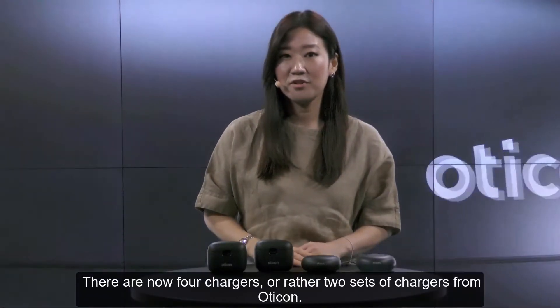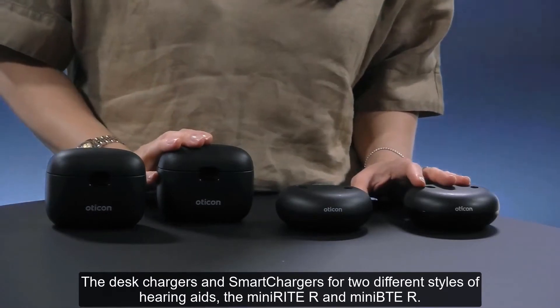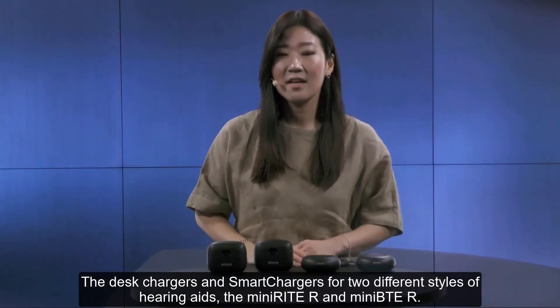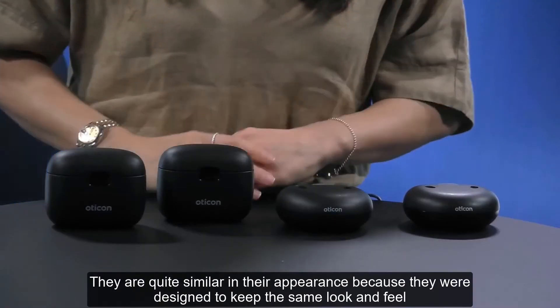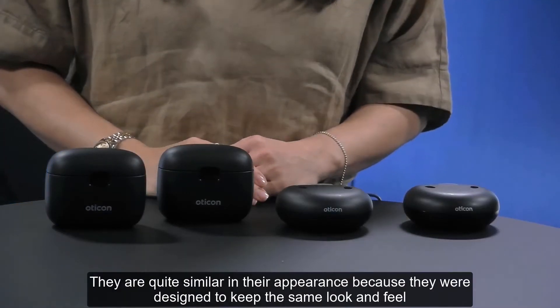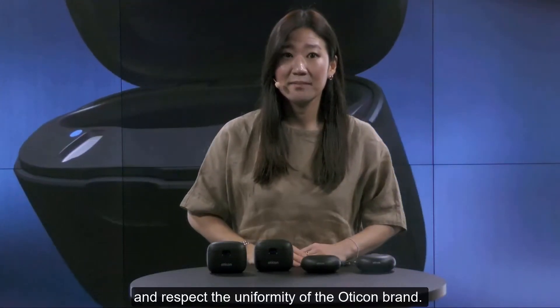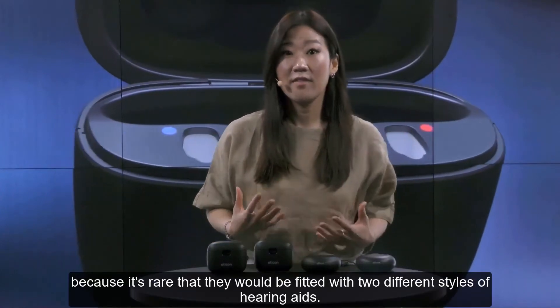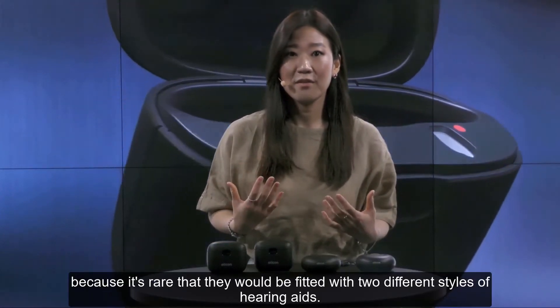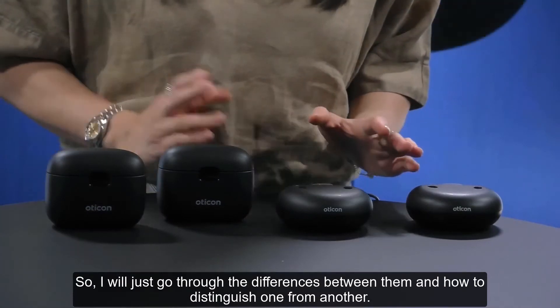There are now four chargers, or rather two sets of chargers from Oticon: the desk chargers and smart chargers for two different styles of hearing aids, the Minirite R and Mini-BTE R. They're quite similar in their appearance because they were designed to keep the same look and feel and respect the uniformity of the Oticon brand. It's unlikely that this will impact hearing aid users because it's rare that they'll be fitted with two different styles of hearing aids.